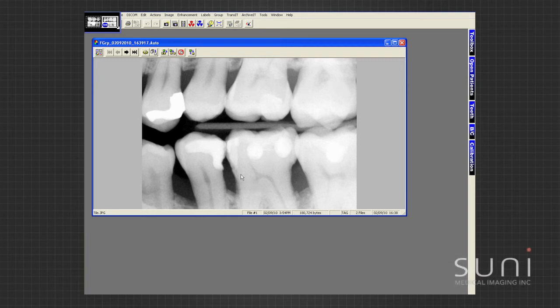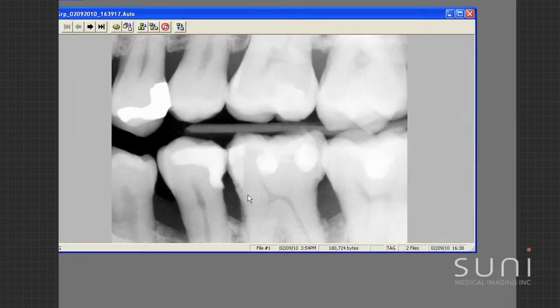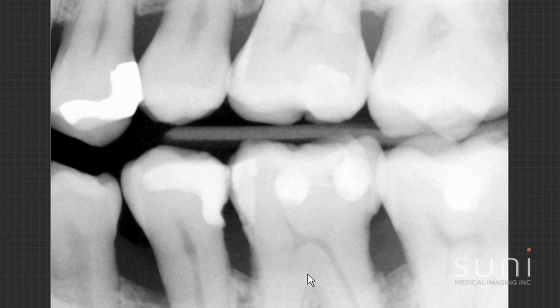This is case number one, bitewing X-rays. With the Suni sensor you can see how clear the image is — really good detail. We're always looking for interproximal decay, and I can see really good detail. I can see where he has some bone loss; he's an older guy. I'm looking for interproximal calculus buildup and I don't see any. With the image quality, I have all the information that I need.